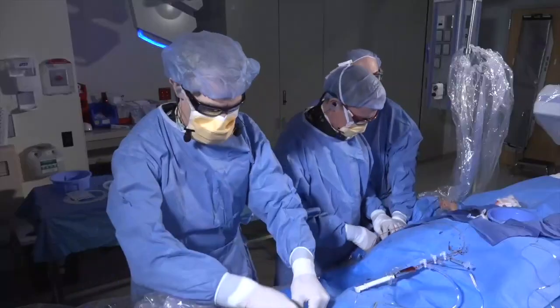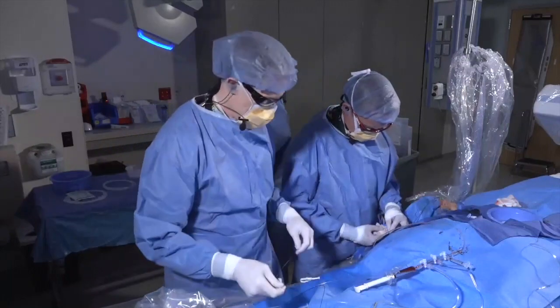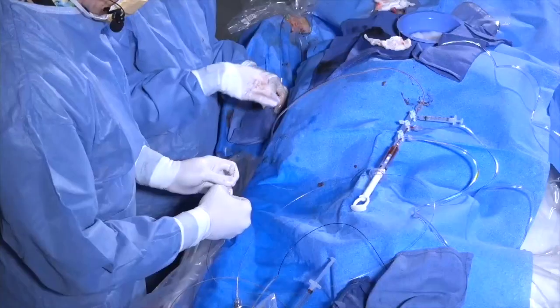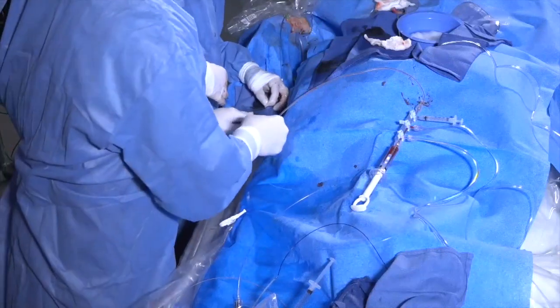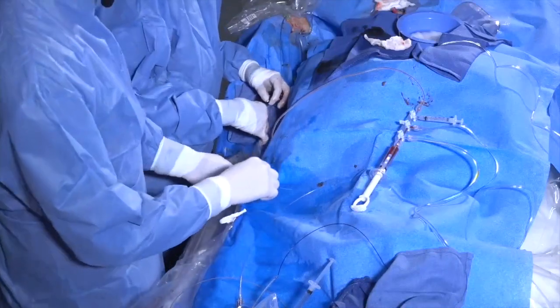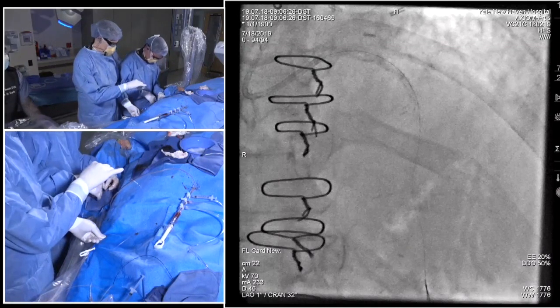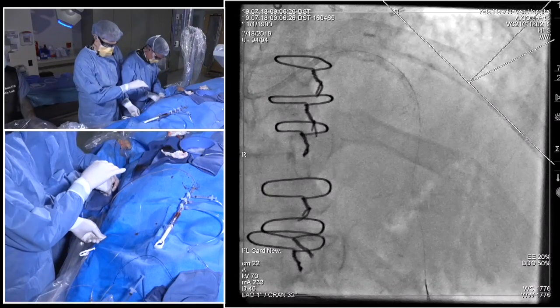So what balloon are you going to use, Mike, to pre-dilate that lesion? We're going to use a 2.5 NC Emerge, a 2.5 by 15. So don't ever make the mistake of atherectomizing and then trying to deliver a stent directly. You really should pre-dilate, typically with an NC balloon, to make sure you have adequate expansion first. That's the ultimate roto regret. Yeah, that's right. It's even worse than not having used it at all. Exactly. That's the ultimate roto regret.